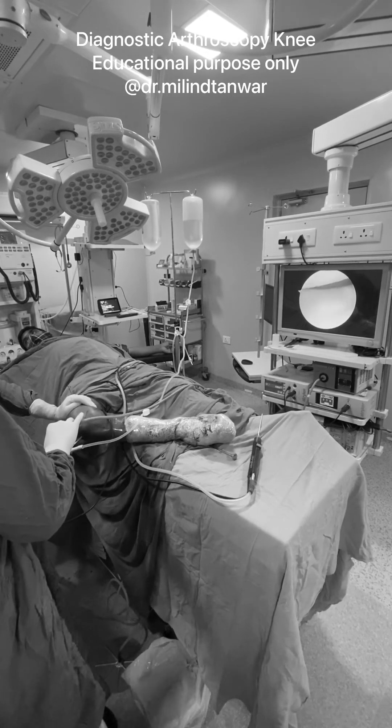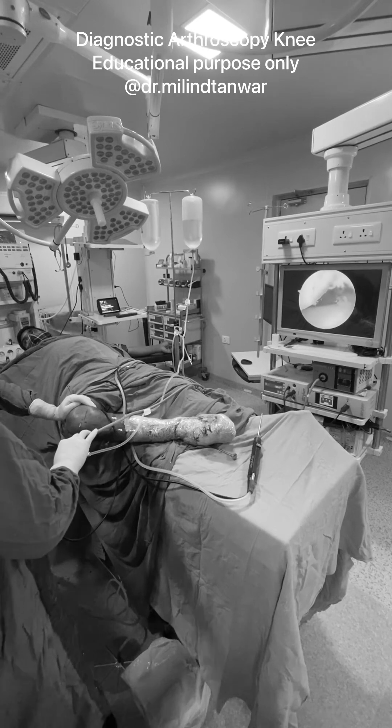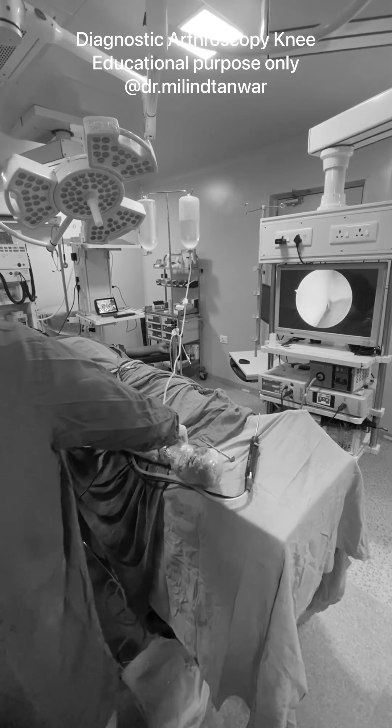Arthroscopy is all about keeping your camera stable. If your camera is stable, more than half of your work is done. We will now proceed with inspection of the gutters.